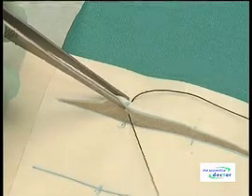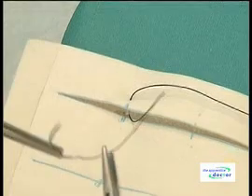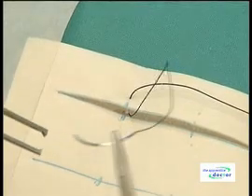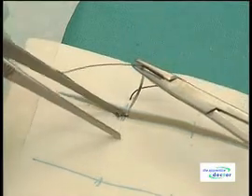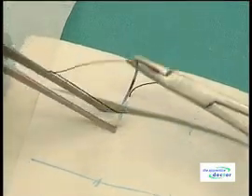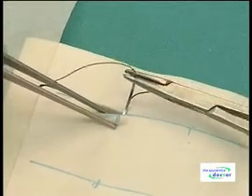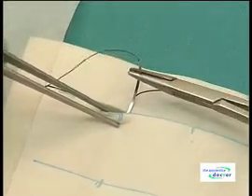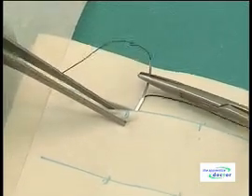Assist the emerging needle through the tissues with the needle holder or tissue forceps, then deliver a reasonable section of suture thread. Reclip the needle holder with the needle tip facing downwards and towards you. Lift up the imitation skin on the near side of the laceration using the tissue forceps and insert the needle in the depth of the tissue on the near side, exactly opposite the spot where the needle emerged previously.